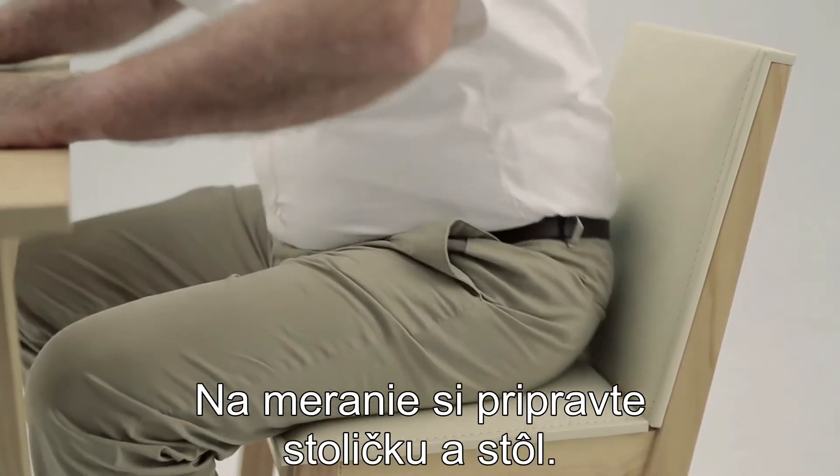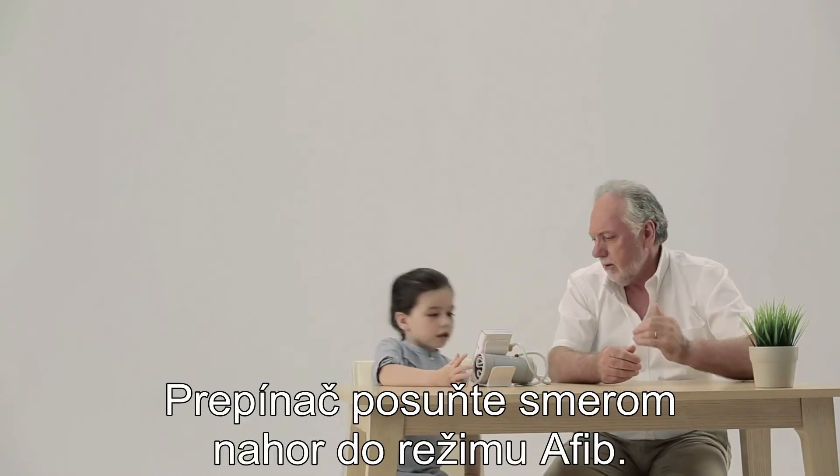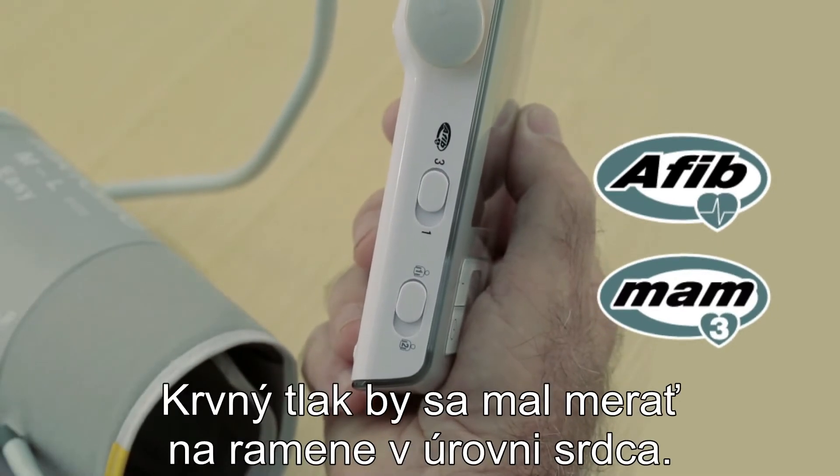Prepare a chair and table for the measurement. Slide the switch upwards to Afib mode. The arm with the highest blood pressure should be measured.